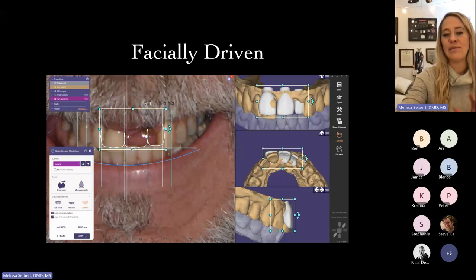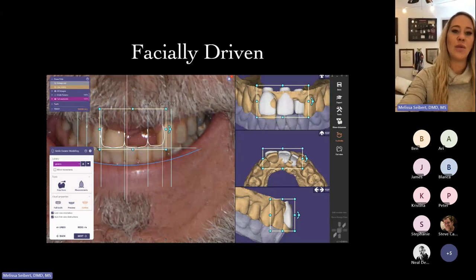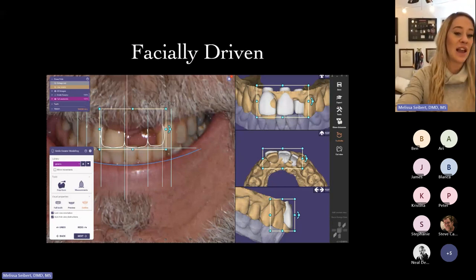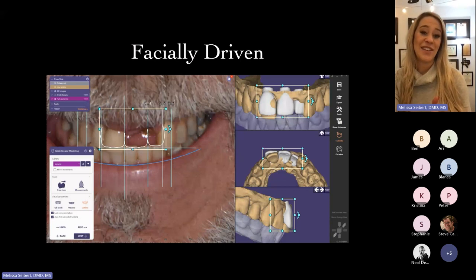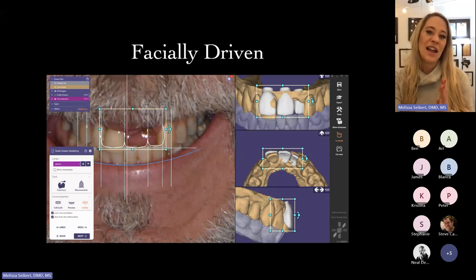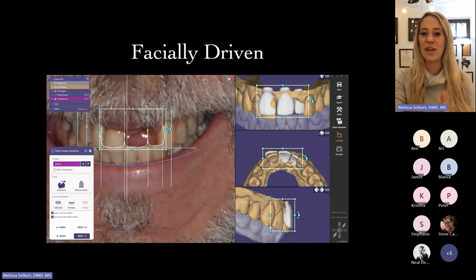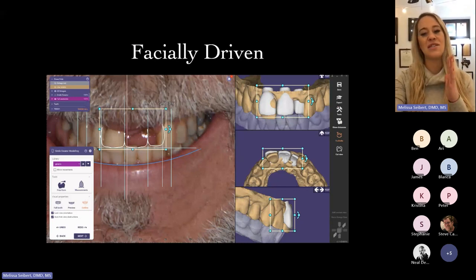We want our implant planning and treatment planning to be facially driven. Here, I'm using ExoCAD's DentalCAD application — their smile design feature — where I can position the teeth in space where they should be, based on the patient's smile and the patient's desires.